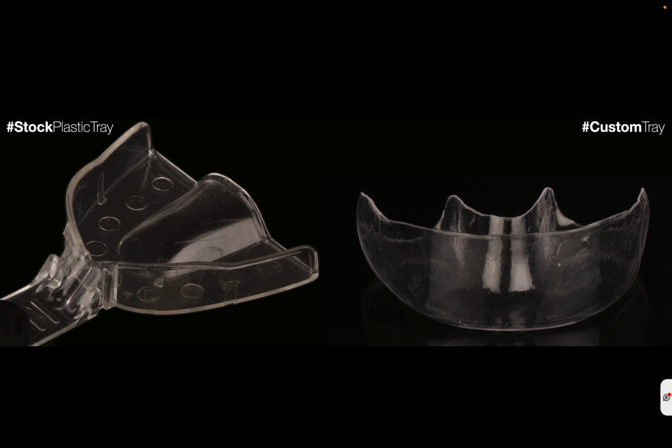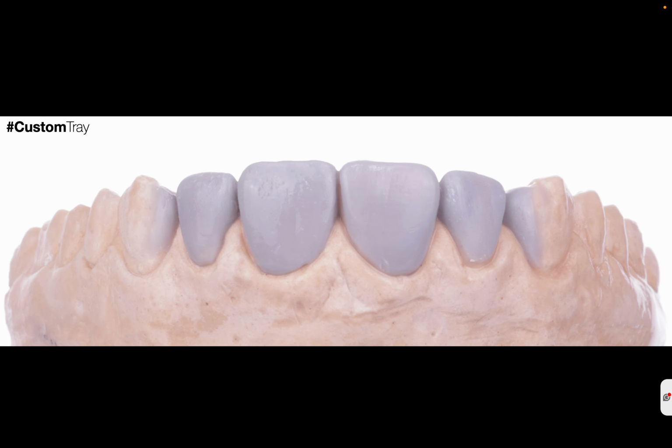So we need a tray to put the silicon in. For that, you can use the stock trays, which can be very convenient because you already have the shape of the mouth, or you can create a custom tray by yourself. It's important that both trays are completely clear, okay? Just to see where your silicon is.